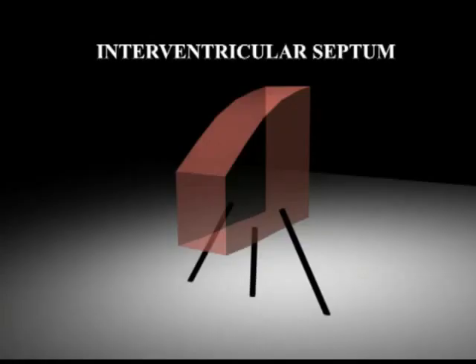As shown here, the interventricular septum is of course a three-dimensional structure. Depolarization of the septum does indeed spread from left to right, as we've seen in our two-dimensional schematics. But in 3 dimensions, you can see that this left to right movement also travels upwards and somewhat backwards from the lower part of the left side of the septum towards the upper part of the right.